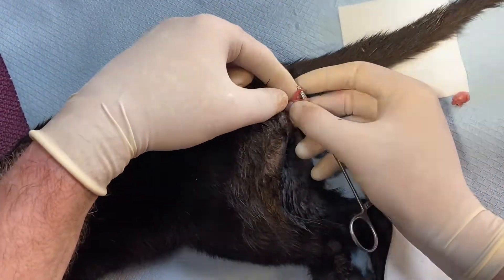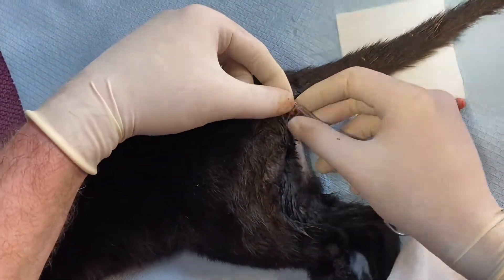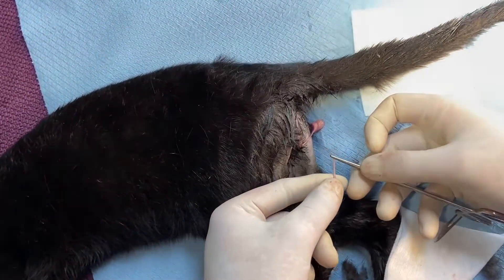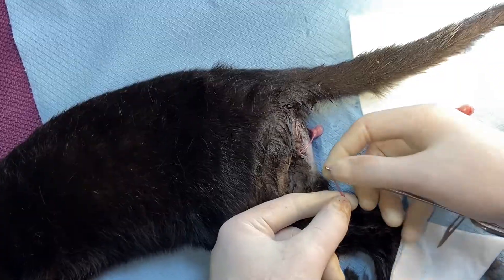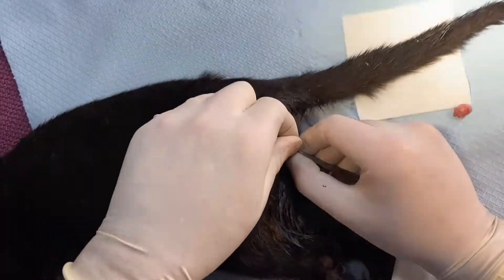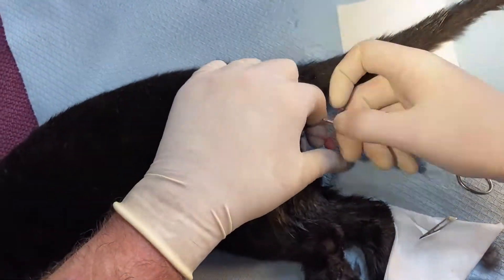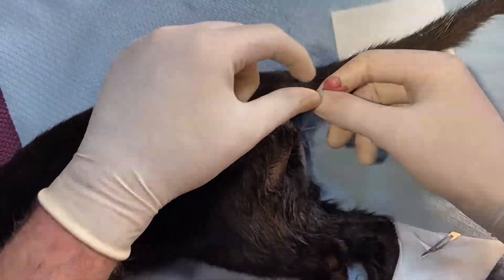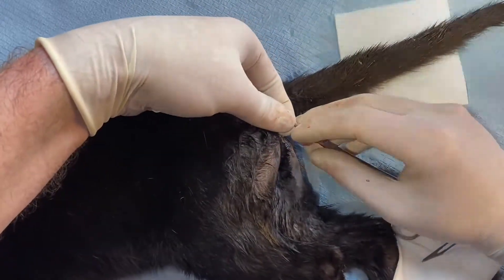Just go around, tying the testicle. See, I've got more here — I'll demonstrate if it broke early. It effectively sort of lengthens it and allows you to get more on.